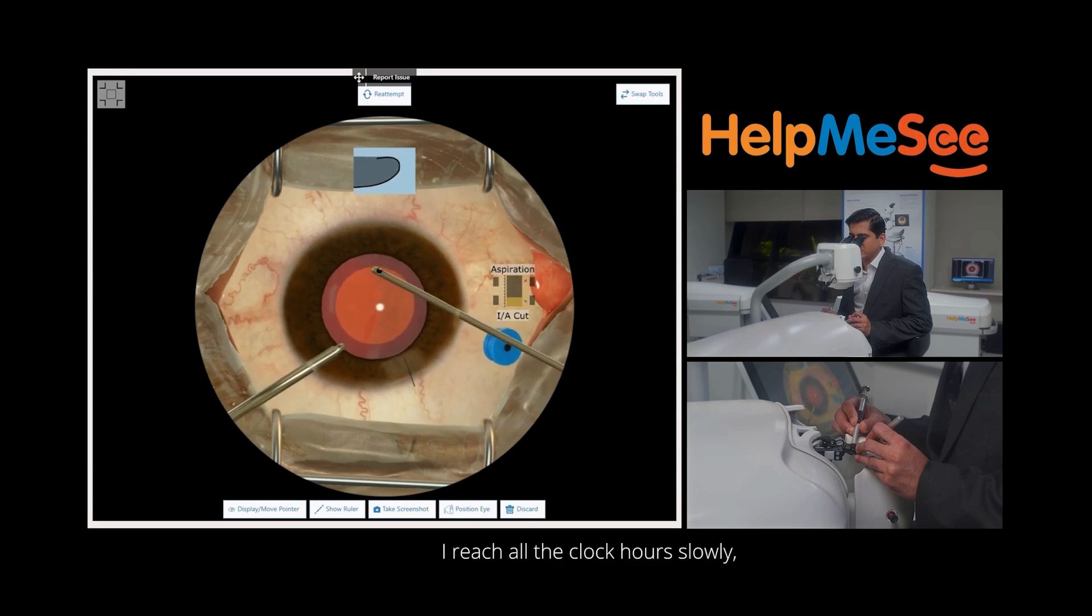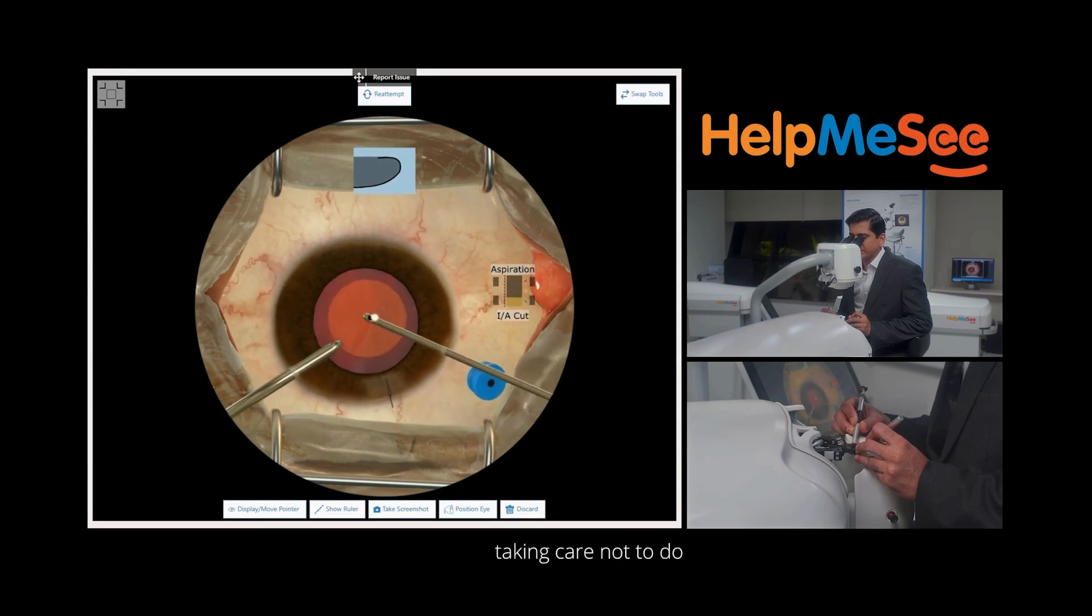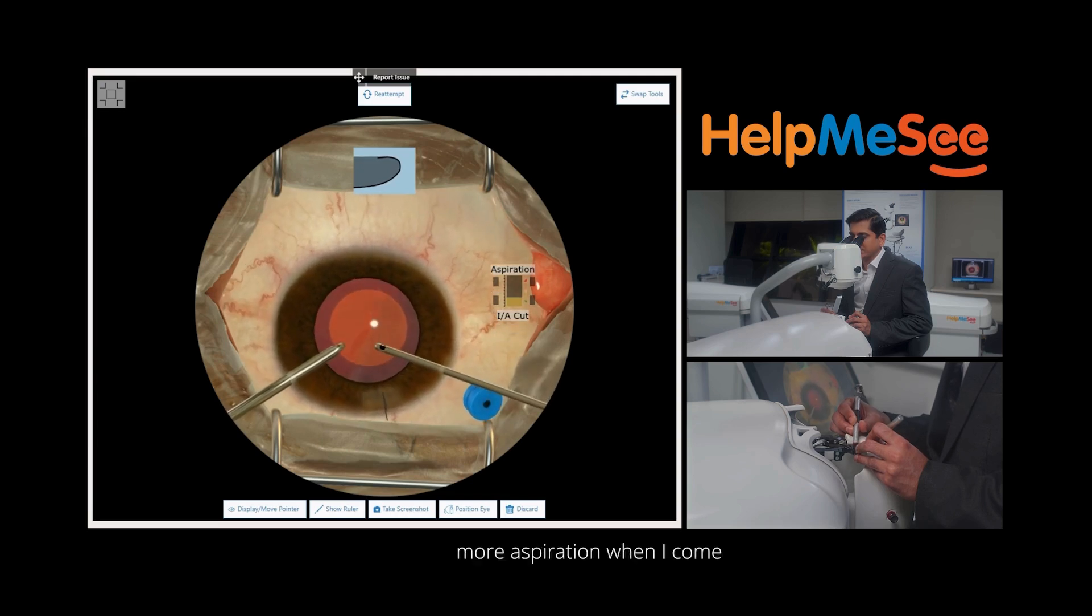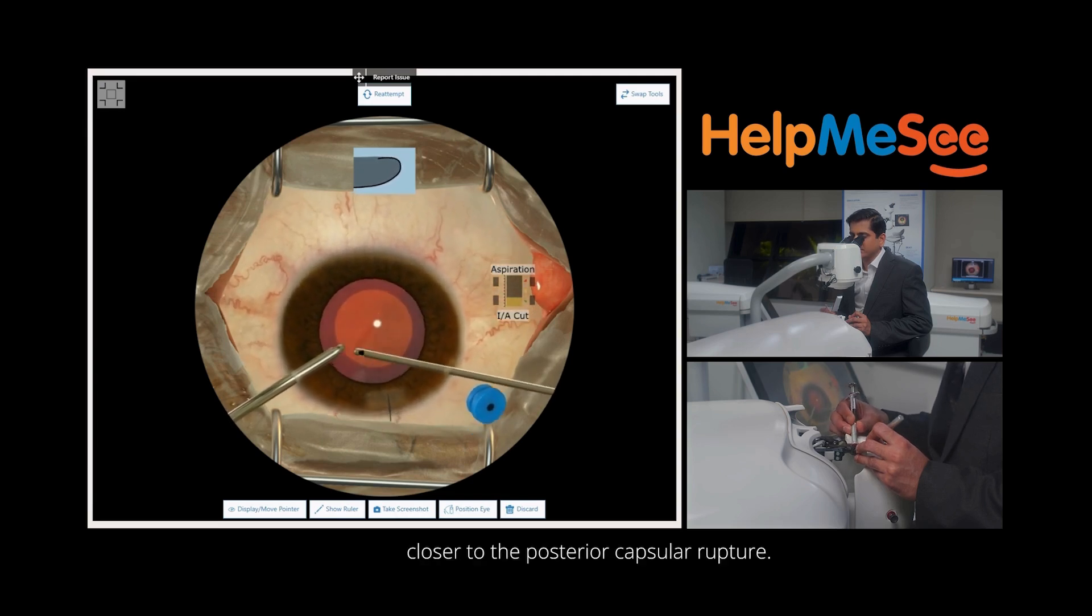I reach all the clock hours slowly taking care not to do more aspiration when I come closer to the posterior capsular rupture. Chances are that it might still extend but we have to be careful.